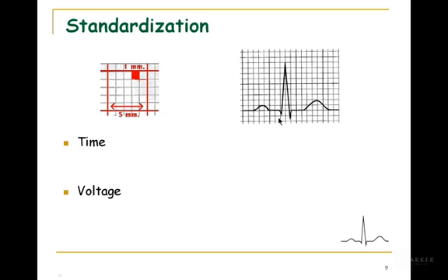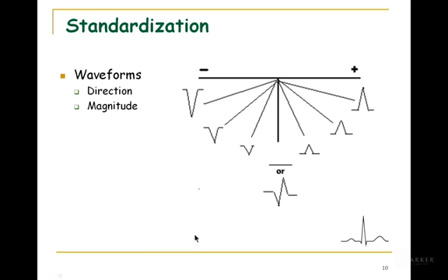Well, why is the P wave upright? Why is the Q wave downwards deflected? Why is the P wave not as high in amplitude as, say, the R wave? These are some other things that we need to be aware of. When they did the EKGs, these are rules. Okay, these are hard and fast rules. Nothing's going to change this.